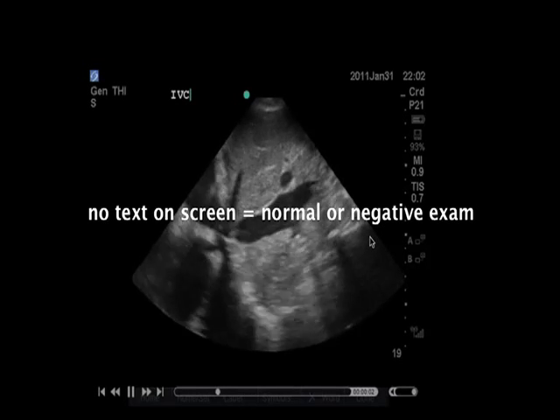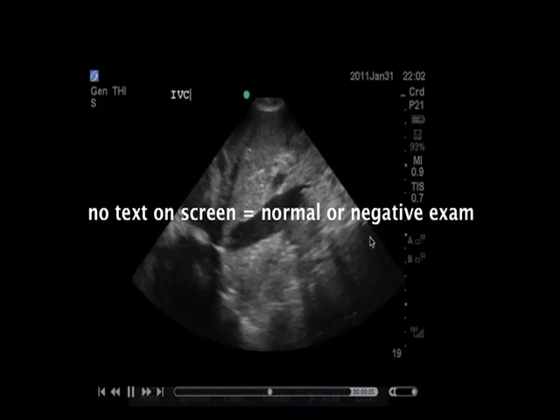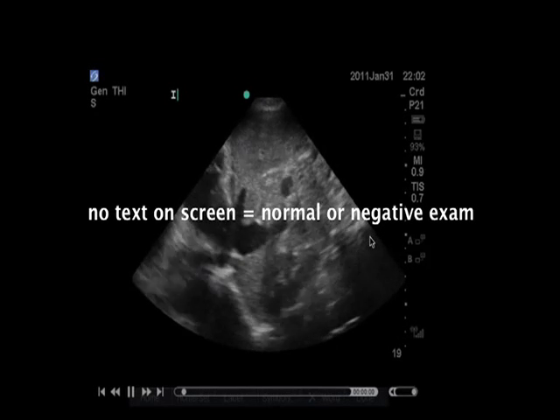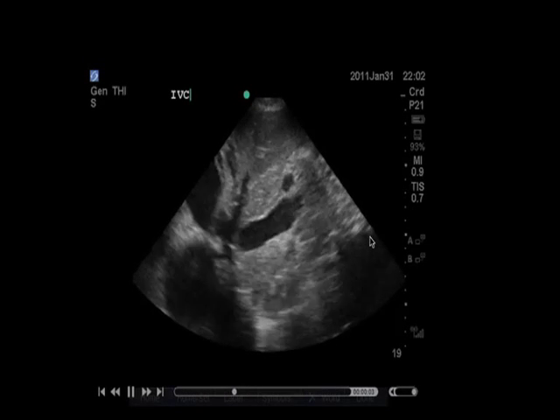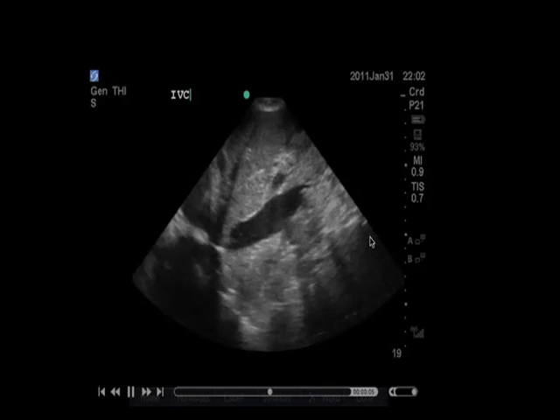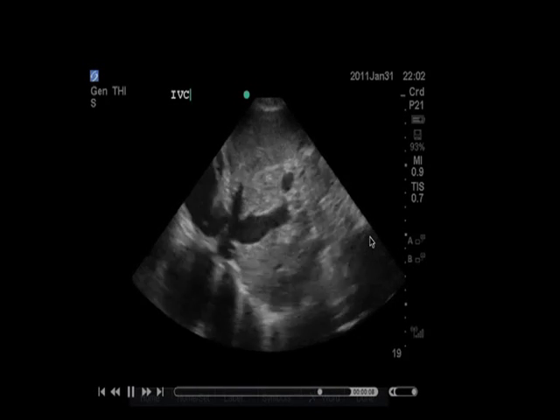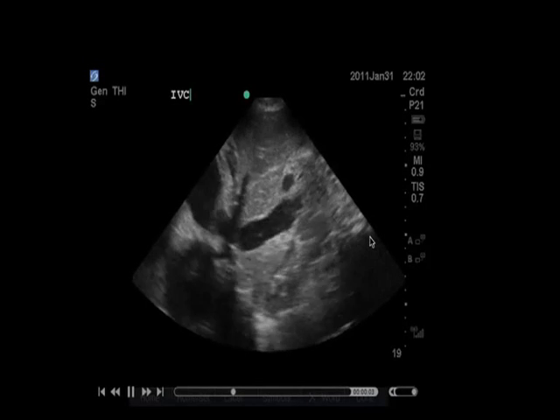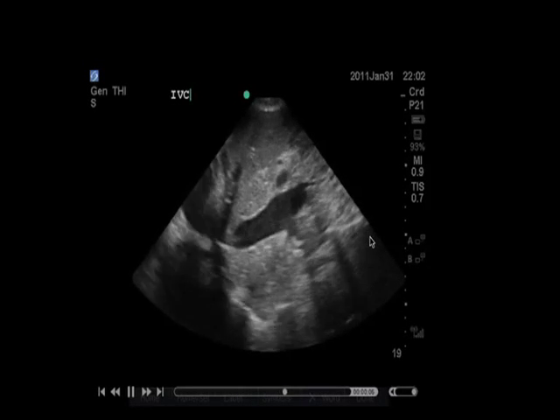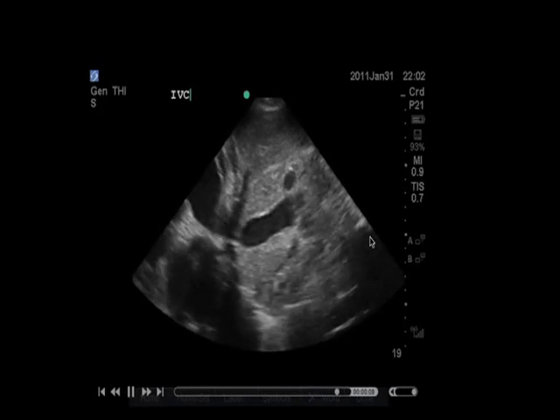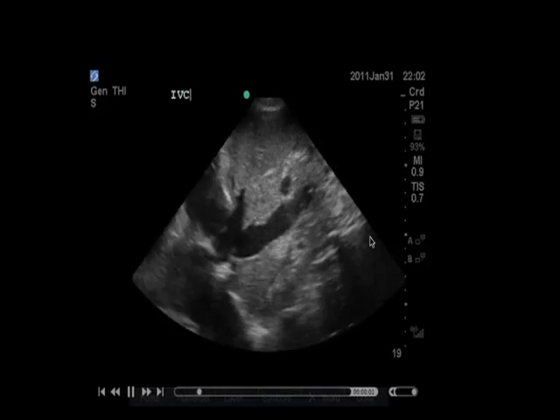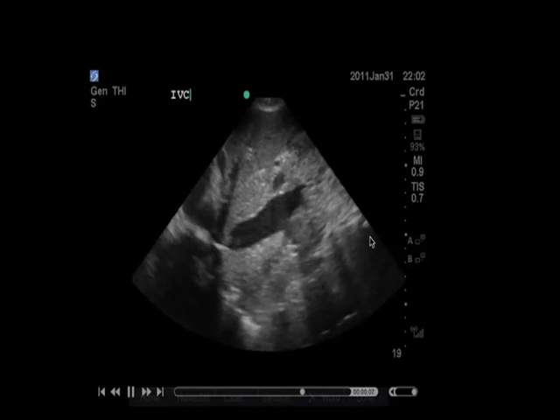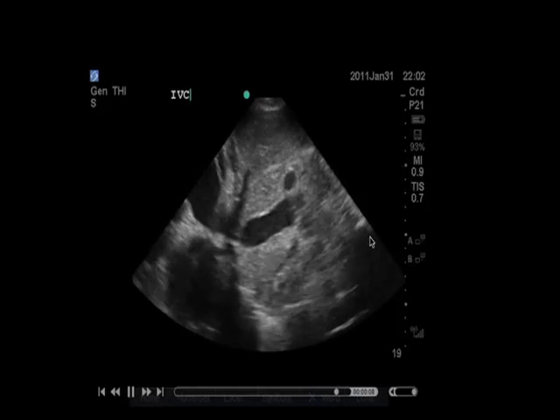That's a work-saving step. So for a normal FAST exam, for instance, you save your images of the right upper quadrant, left upper quadrant, and pelvis, and no annotation is required. If we saw a sliver of free fluid in your saved images and there is no text on screen, that would trigger a discrepancy, and you would receive an email follow-up asking whether you saw the free fluid. So: if your exam is normal or negative, no annotation needed. If it's positive or there are qualifiers you wish to communicate, please annotate them on screen by typing them in.